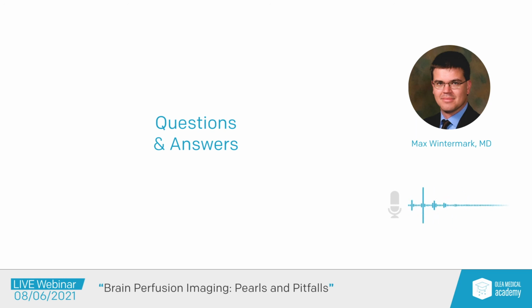Because if you truncate it, then it may lead to miscalculation of the CBV. And so that's why typically the protocols are established such that you cover and you don't truncate that venous output function curve in order to calculate your CBV volumes correctly. Otherwise, it could accentuate that issue of the reversal. So that's what I had to say on that particular topic.